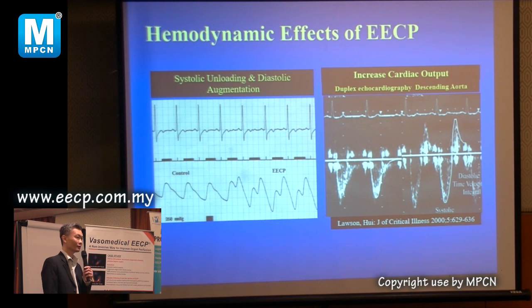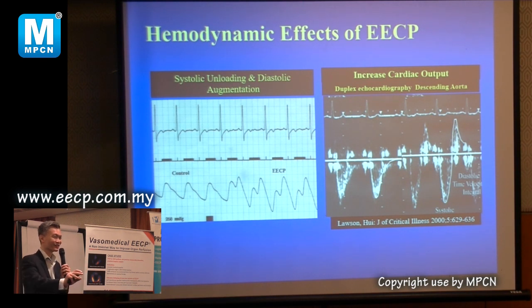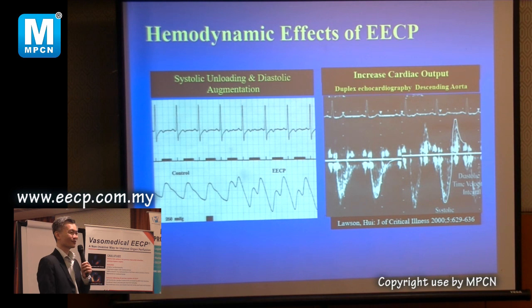So what about varicose veins or patients with venous insufficiency? Yeah. For varicose veins, my advice is also not to do it, because their veins are already swollen and not so strong. If you keep squeezing, sometimes it can cause bleeding. But that's my advice, you can experiment and tell us. But when you do this, I think the Ministry of Health is watching carefully. If it causes harm, you are the first one to be in the newspaper. So you have to be careful. Do the proper thing first.